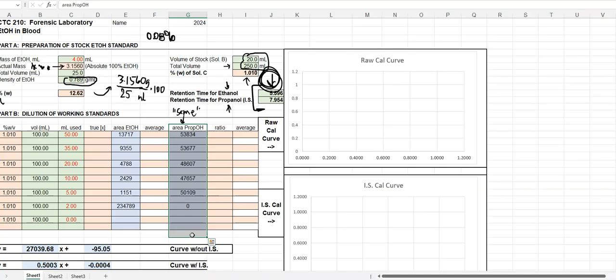All of that sample prep, all of the standard prep doesn't mean anything anymore. And that's because you forgot to add that one little thing. And now everything stops in the analysis until we get a really good standard one that we can key into the system. Well, we're actually not going to key it into the system, right? We've got the freedom to do so. And we do not like this 0, so we're just going to delete it. We're going to get it out of there. We're not going to have a standard one.